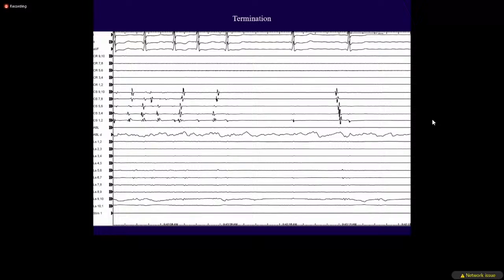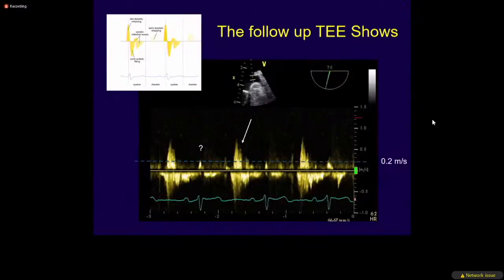Doesn't it look like there's still AFib on the surface? No, the first sinus beat is actually, you see the P wave there. We have cases of appendage that was isolated in fib or flutter, where you see some activity, but if you look at the first beat with sinus, it's the last one that you see, and you actually see a P wave there. It's just very bradycardic. I wonder if you see fibrillation also? It happens sometimes, yes, but it's very rare, I would say.